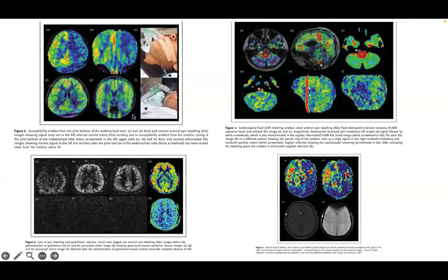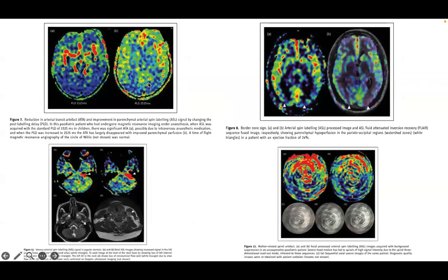Can you go back and see whether it's an artifact? It is really difficult. Many times, in this case, we could actually see the CSF labeling. That's why we understood that it is an artifact. Otherwise, nobody usually will, because in usual MR imaging, this spring has no significance. So we published this in that article on artifacts.